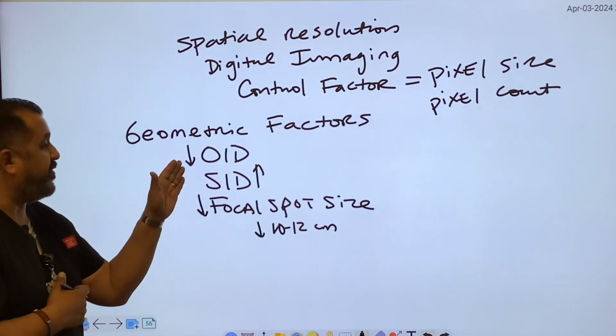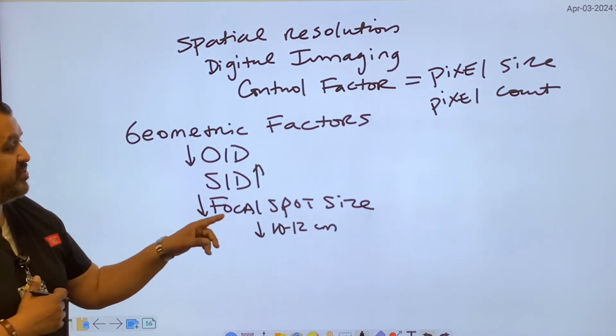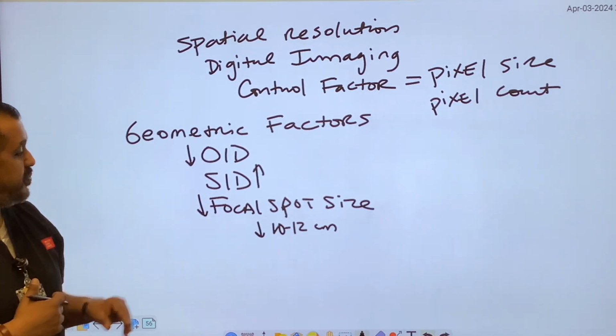If you follow this rule, it's always going to give you the most spatial resolution. So let's explain this here.